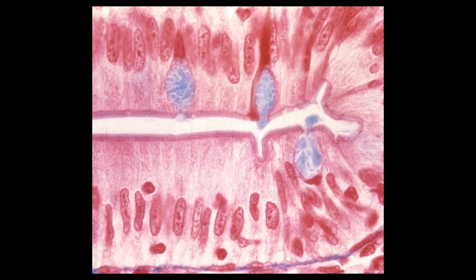Here's an area in the small intestine, again a simple columnar epithelium. I think we showed you this slide in an earlier podcast. So here you can see the nuclei, here you can see the brush border, the lumen of the GI tract here, and several goblet cells are highlighted.